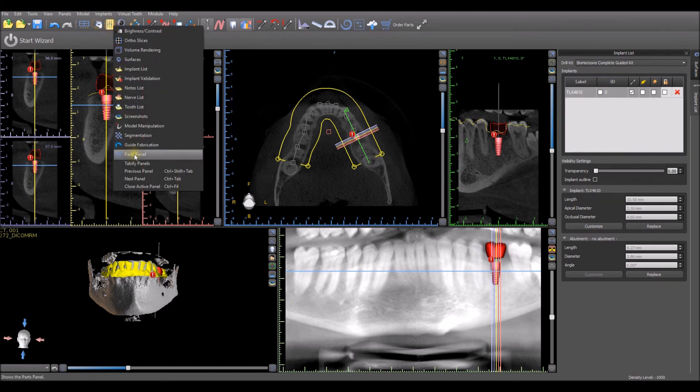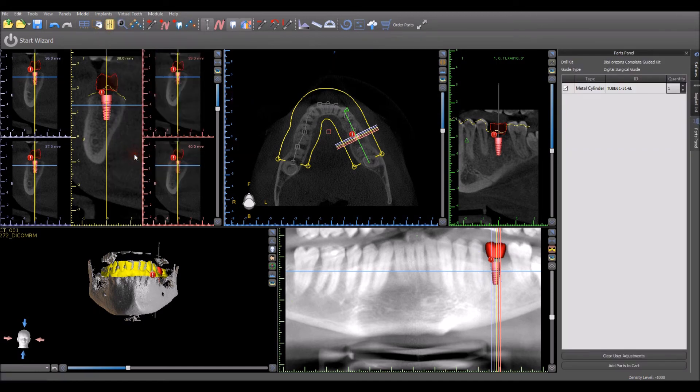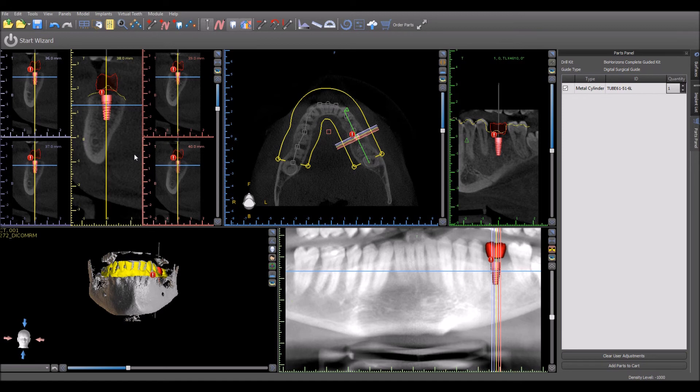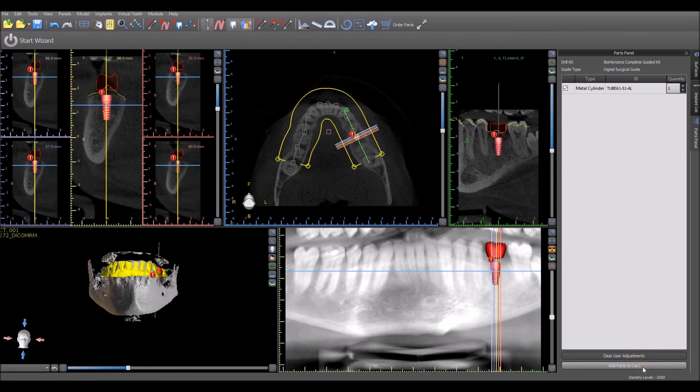The parts panel will include the metal cylinder that can be inserted into the relevant surgical guide for the guided surgical kit and implant that has been selected. Clicking the add parts to cart button will add the metal cylinder to the shopping cart on the BlueSkyBio website.